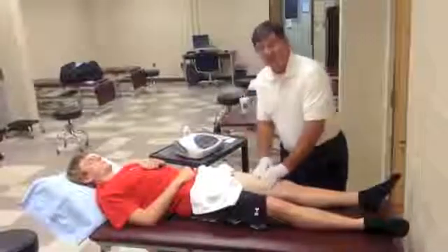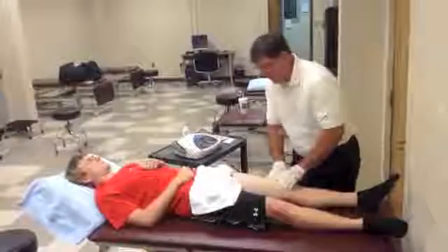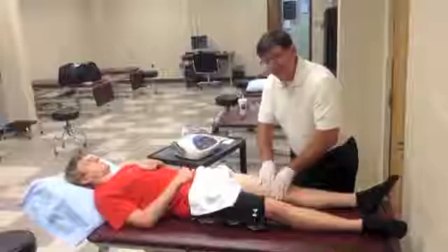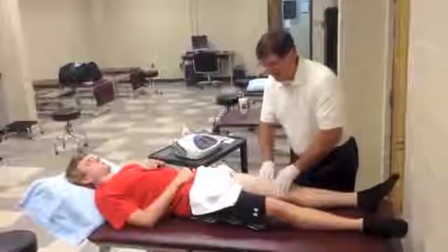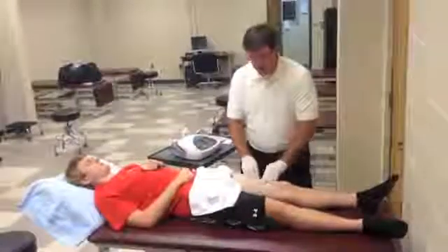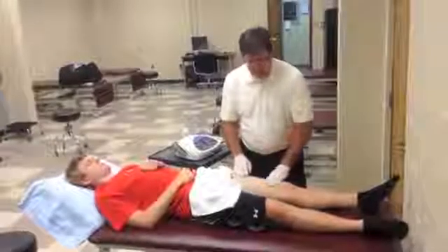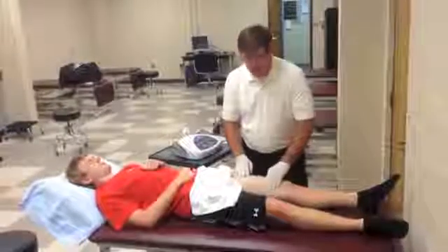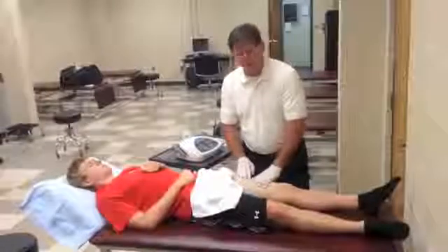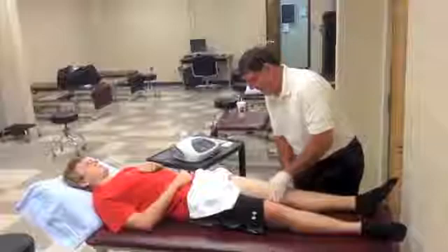Usually we'll deliver this treatment 10 to 15 minutes based on the patient's response, and it does have quite a blood pressure effect. I have noted personally that whenever I do two or three of these treatments in succession, I actually experience some lowering of my own blood pressure. So it's a pretty dynamic treatment in that regard.